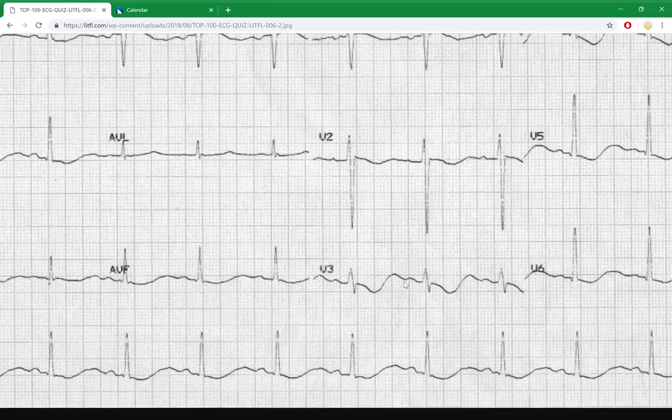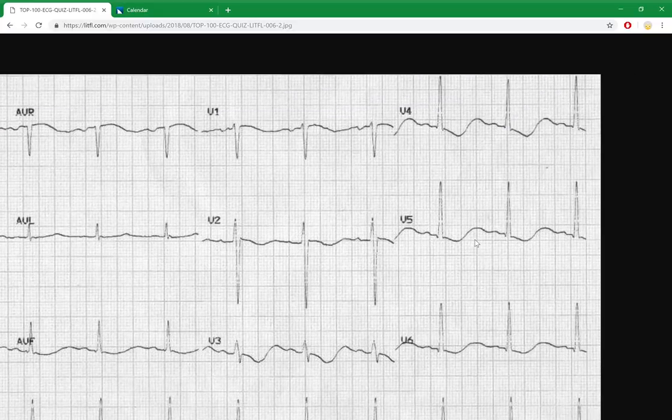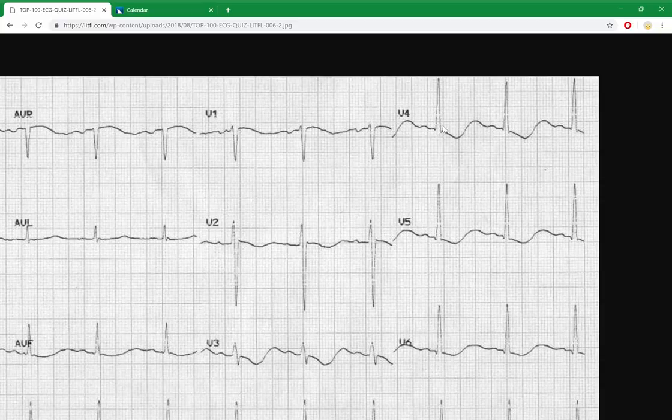We have a normal P wave. The QRS is really an RS complex, which is the ventricles depolarizing. Then when we would normally see an ST segment and T wave, we see an inverted T wave, but then it comes all the way back up, not to baseline, but over baseline for another positive deflection, and then comes back down, followed by a P wave for the next beat. It's like that in V4: QRS, an inverted T wave, then this huge positive deflection before the next P wave.